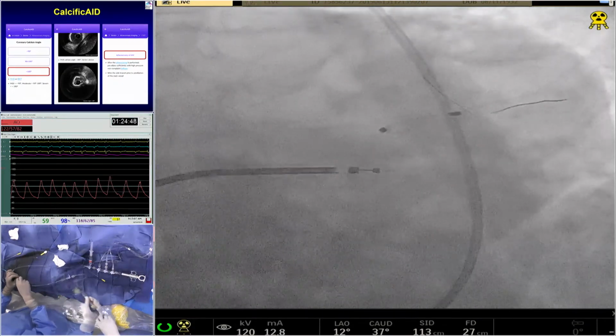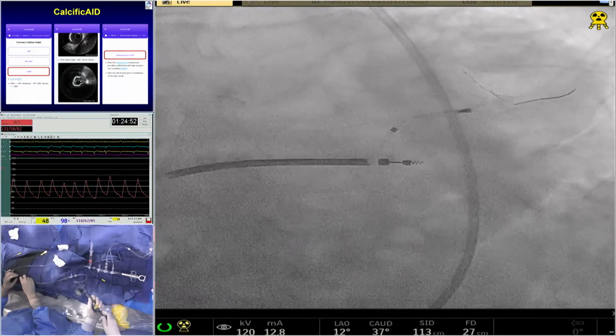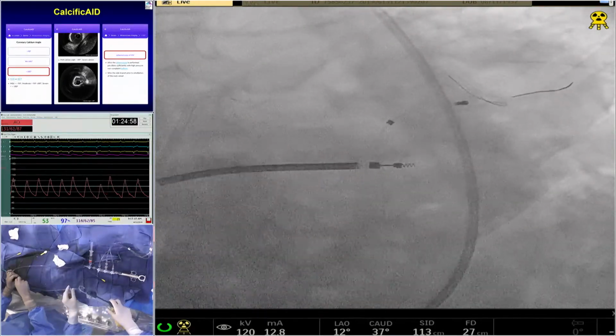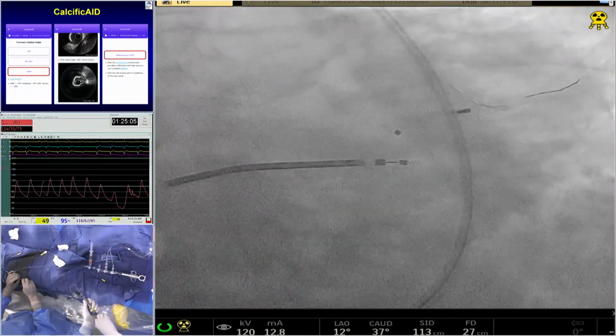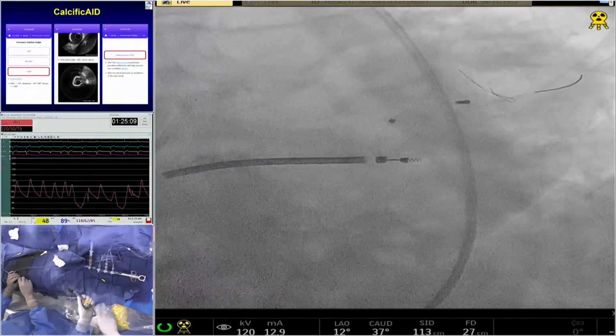I do think there's likely going to be a 2-stent technique here, depending on what happens to the ostium of the circ. Because the LCX is less than 70 and the osteal lesion is less than 10 millimeters, provisional can also be considered. So there are two options. Next one: as Dr. Colombo said, I will try to use a drug-eluting balloon for the circ and not stent.